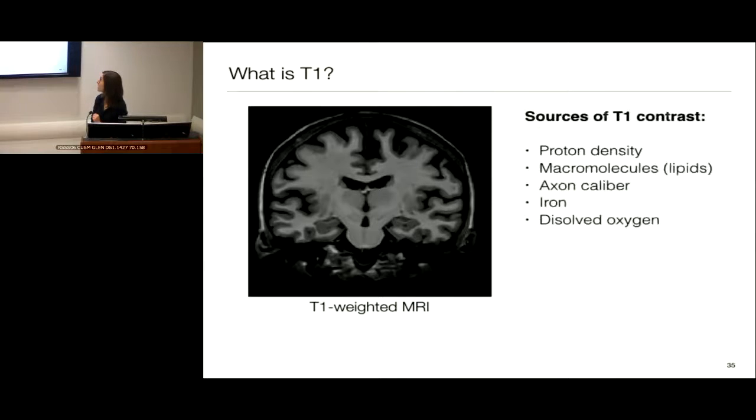So this brings me back to this slide that we looked at earlier. Even if I use quantitative T1 to look at the myelin of the cortex, in the maps I showed you earlier where we're contrasting different cortical areas, I was pretty confident in saying the main source of the contrast there is myelin. But if I see change in T1 in subjects over a period of time because they're learning a new skill, I'm not as confident about my interpretation because of this.